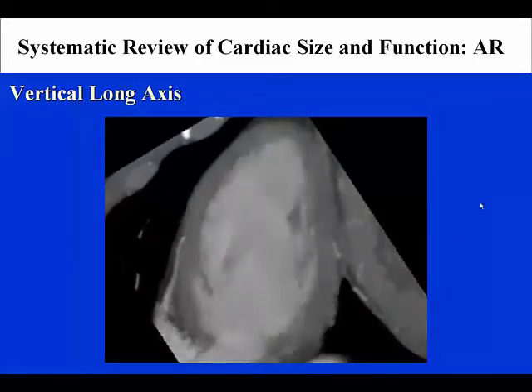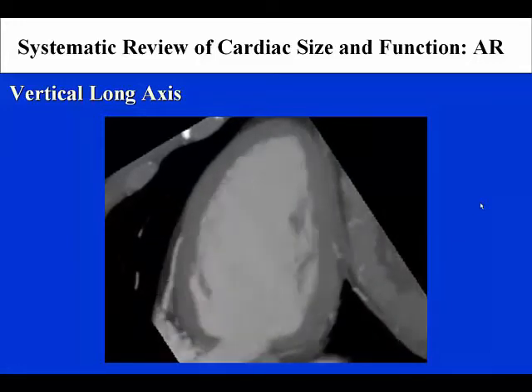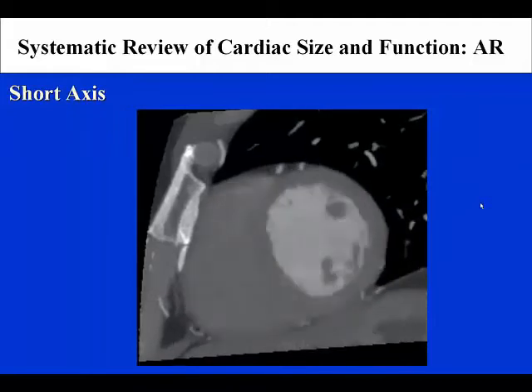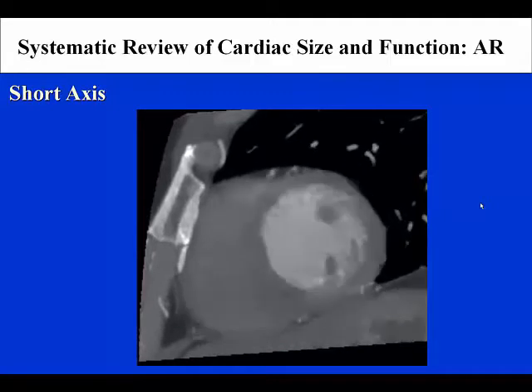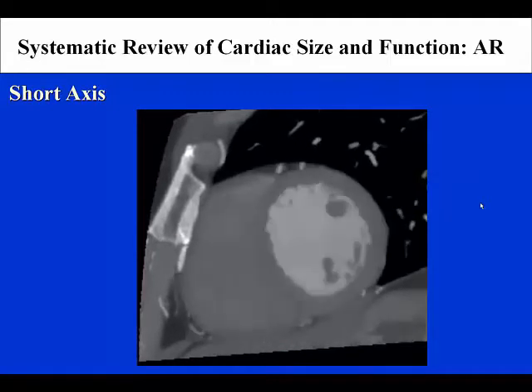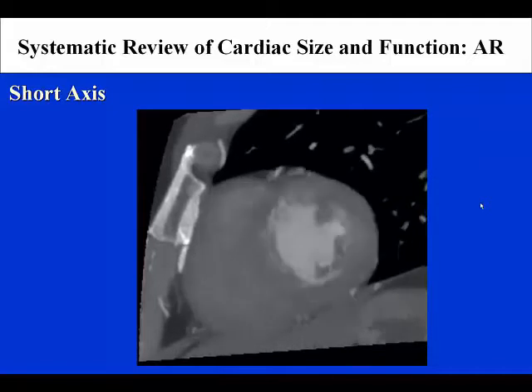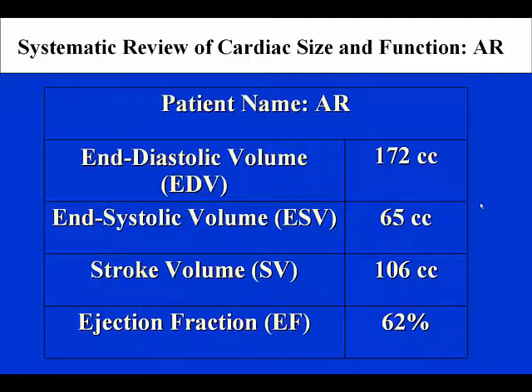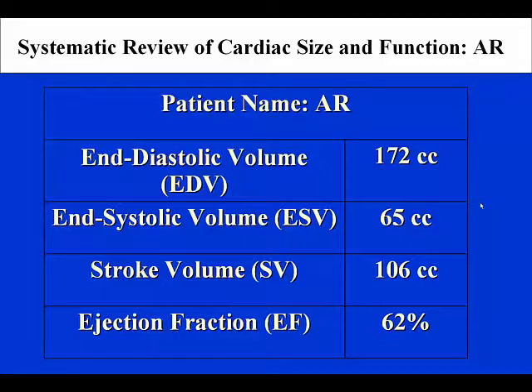Finally, one can present the data in the mid-ventricular short axis, demonstrating the entire circumferential aspect of the left ventricle, again demonstrating normal motion in the anterior wall, lateral wall, inferior wall, and interventricular septum. From such analysis, quantitative data on this individual's left ventricular end-diastolic volume, end-systolic volume, stroke volume, and ejection fraction can be obtained. These values are all within the normal range.